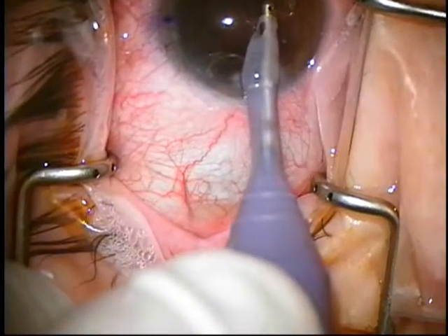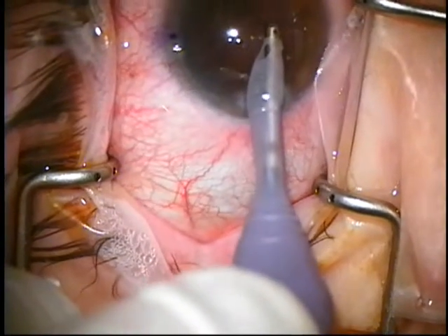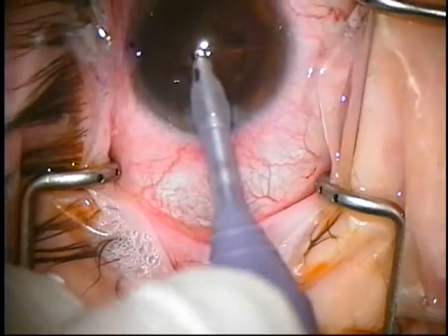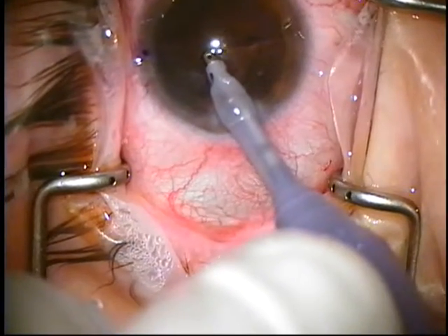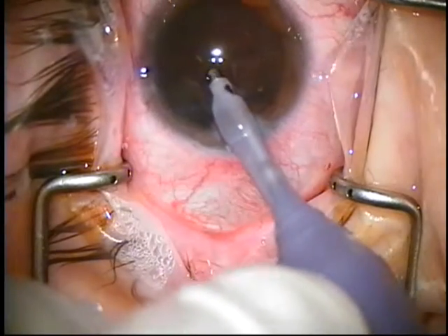There are a few little pieces of cortex in the AC that I'm just going to take first so my view is clear. Now this is called an ice cream scoop method — let's eat that piece up.